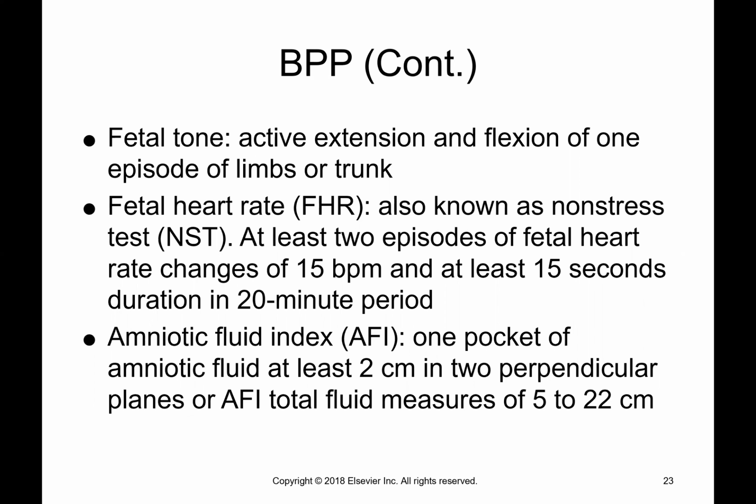Now, the interesting thing about this is you can have oligohydramnios and still pass your biophysical. So if you have 1 pocket of fluid in your amniotic fluid index that's 4 centimeters, or 2 pockets that are 2 centimeters, you can still say, yes, they pass their biophysical. However, they still have oligohydramnios.